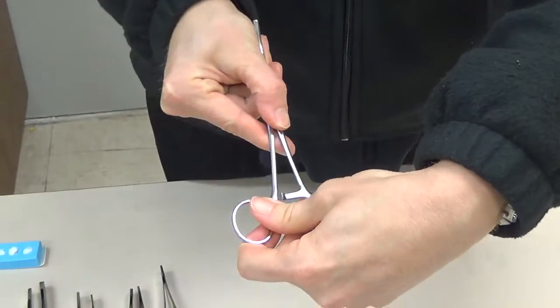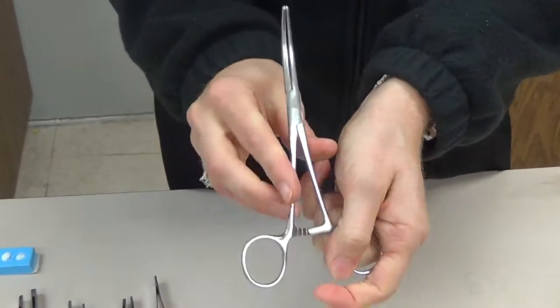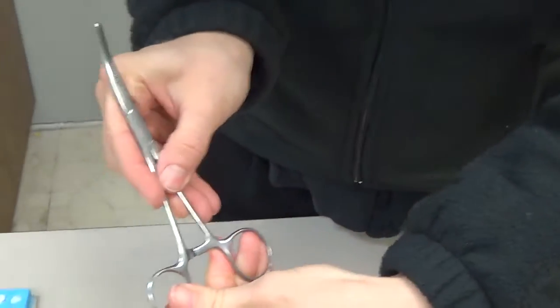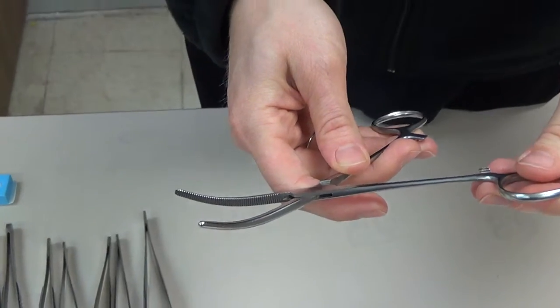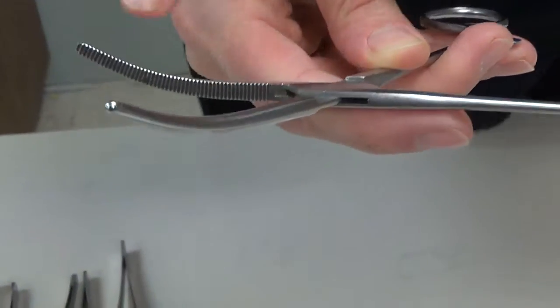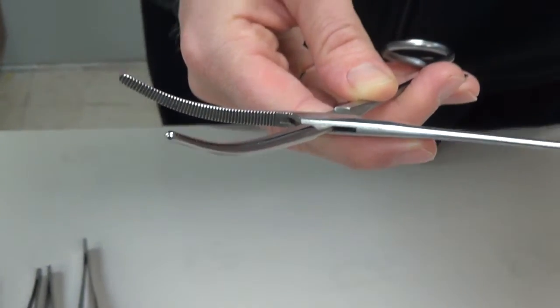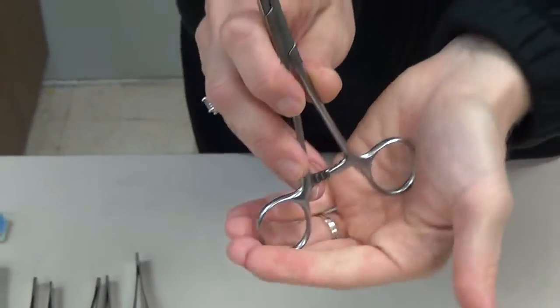We often utilize Mayo clamps to clamp onto the umbilical cord prior to resection when we deliver the fetus on a C-section. We also clamp the peritoneum to elevate it when doing initial dissection through the layers on a basic laparotomy, so we don't cut into the abdominal contents. The serrations on the Mayo go all the way down to the box lock. It does come straight, but we very rarely use the Mayo clamp straight.